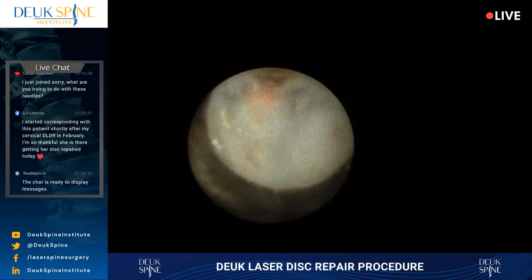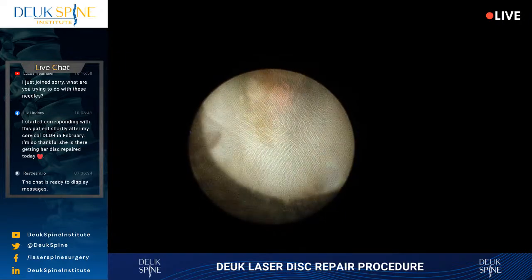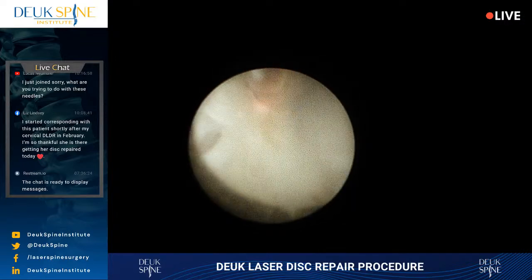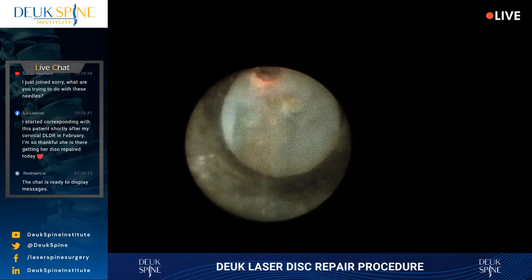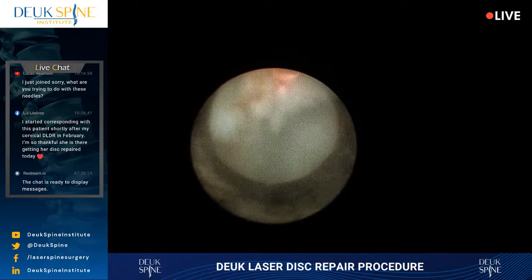And one of the things that is going to affect you if you do endoscopic surgery is the patient's chest. Okay? And what I mean by that is a big barrel chest has a high chest. It makes it harder to do the surgery because you're fighting the chest. Somebody with a narrow chest, much easier to do. But somebody with a big barrel chest, harder.